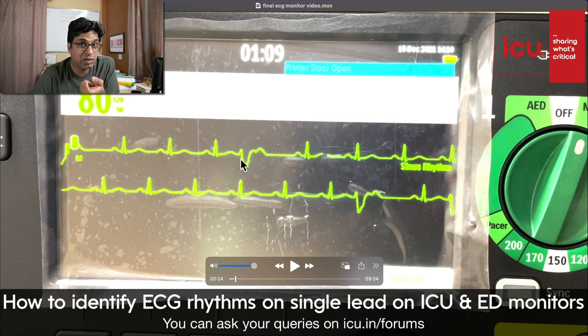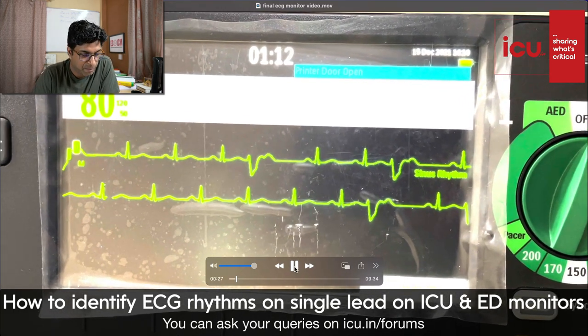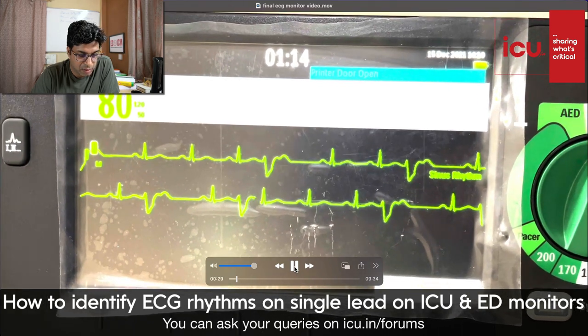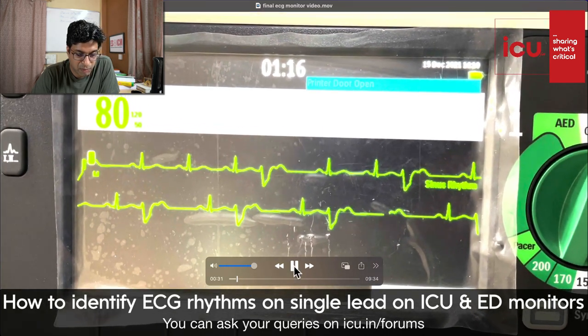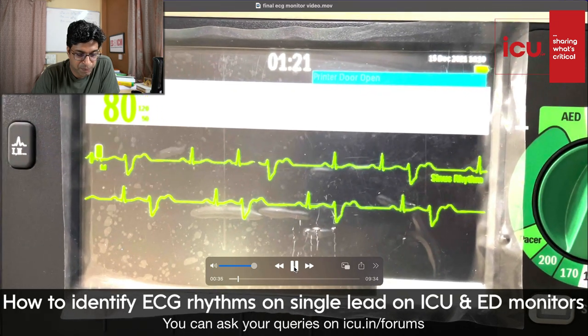Why is it ventricular? Because it's broad. If it had been a narrow complex one, we could have called it PACs. And because it is of uniform morphology and it is coming singly, it is unifocal premature ventricular complex or contractions. Let's see. Fine, same rhythm. PVC is coming.